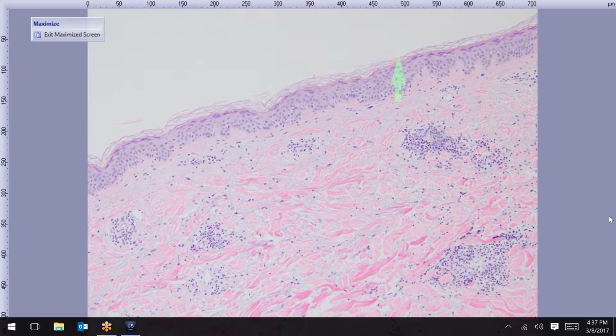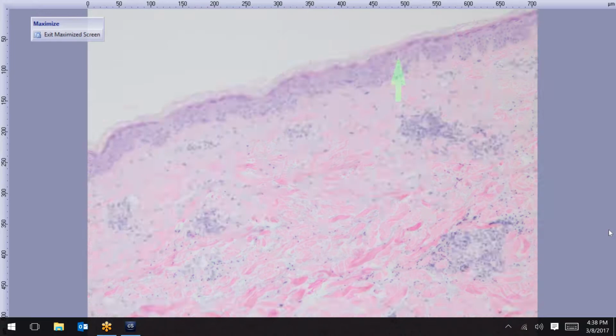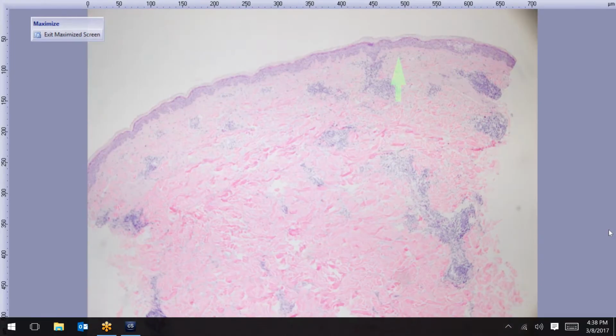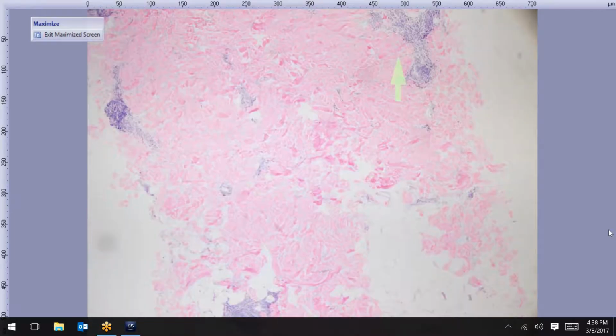A couple people said tumid lupus erythematosus. That's perfect. That's exactly what this is. All right, tumid lupus erythematosus.